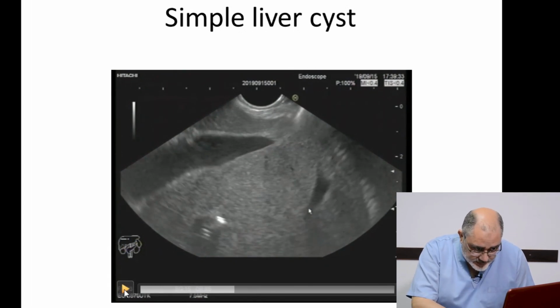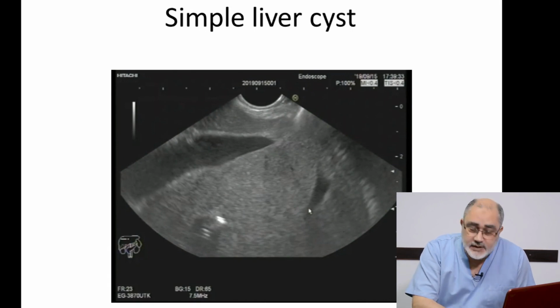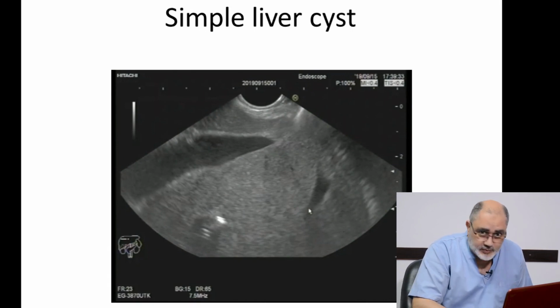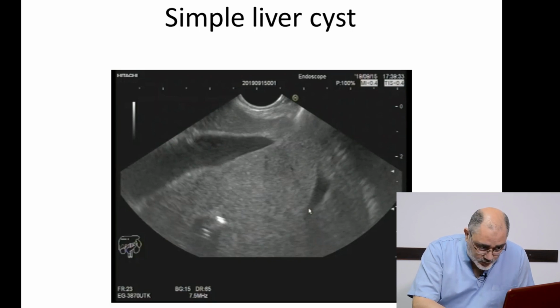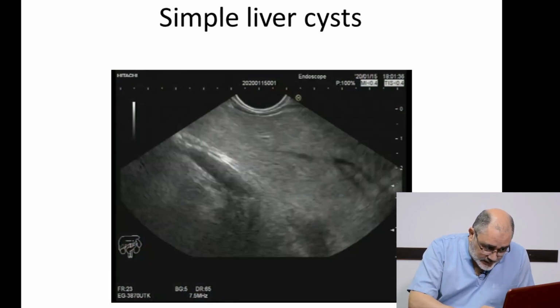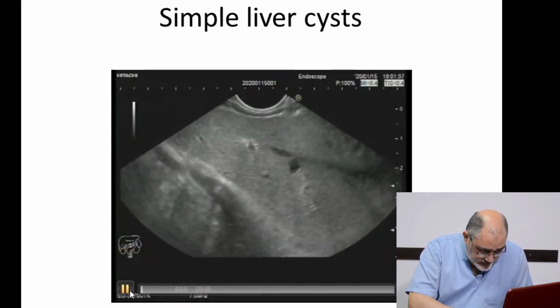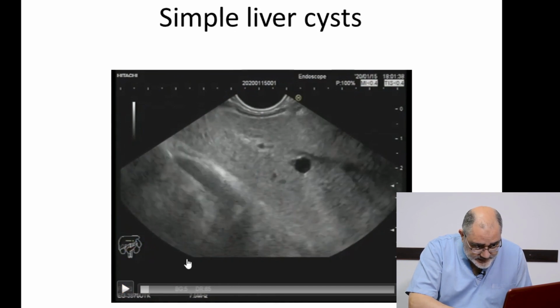It is a very simple cyst, I think a very benign, innocent cyst, because there are no solid components inside and there is no turbid fluid inside. It is totally anechoic with definite posterior enhancement. Let us see this video. Yes, this is another simple cyst.